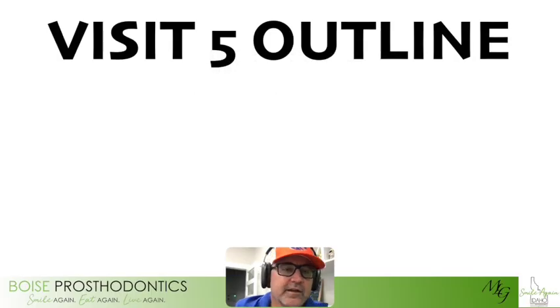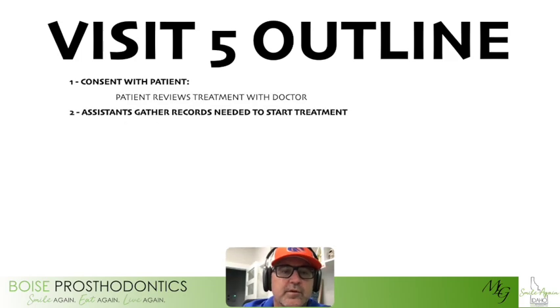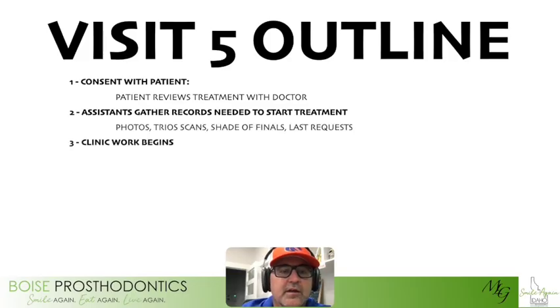Let me just go over the outline of that. Again, we always do a consent with the patient explaining, hey, this is what we're doing today. Do you have any questions, concerns? Here's what to expect. Here's the risks. And if they say, yeah, let's go forward, then we do. Our assistants then gather quite a bit of information and then I'll do some clinical work. Ultimately, it's refining the preps, making them perfect and smooth, and getting the records we need to really have the lab make the best fitting crowns we possibly can.